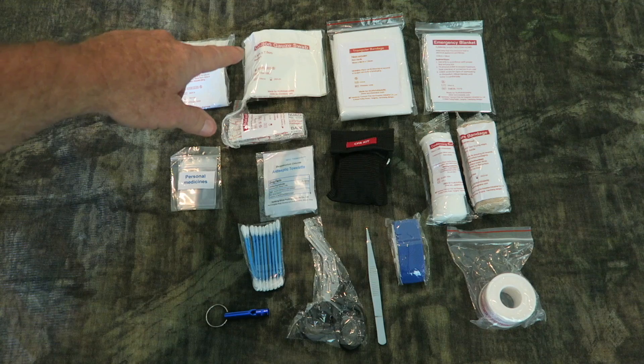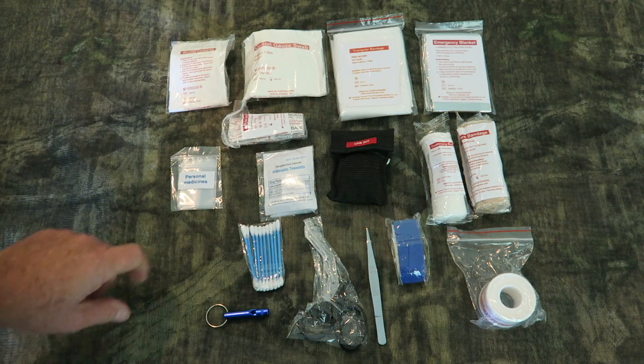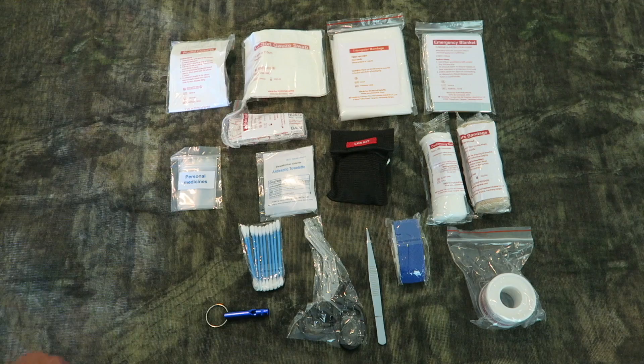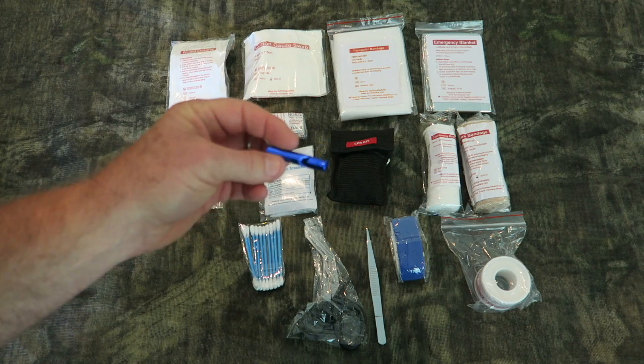Wound closures, cotton swabs, bandages, emergency blanket, more bandages, CPR kit, antiseptic towelettes, band-aids, a little kit that you can keep your personal medicines in, q-tips, scissors, tweezers, tape — it even has an emergency whistle.